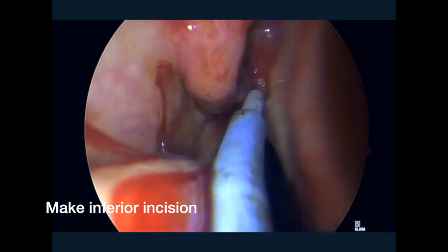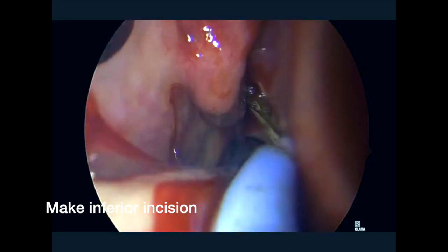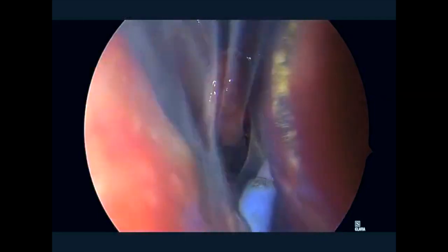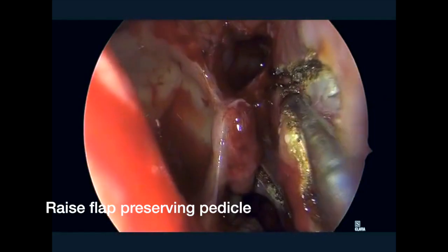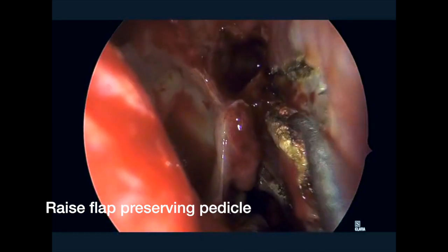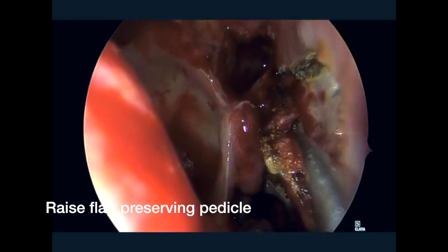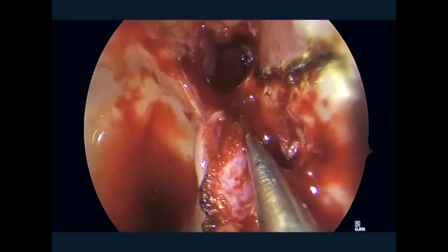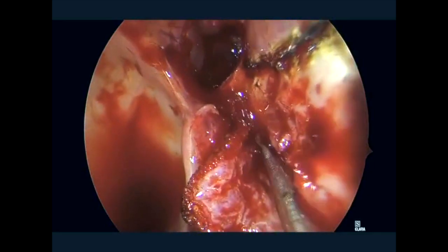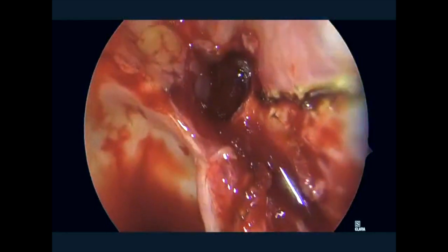The inferior incision, similar to a naso-septal flap, is taken at the superior aspect of the choana and brought forward to connect to the other two incisions. This somewhat limited naso-septal flap is then elevated in a similar fashion off the bone of the vomer, exposing the sphenoid face and keel of the rostrum of the sphenoid, similar to a pituitary approach.